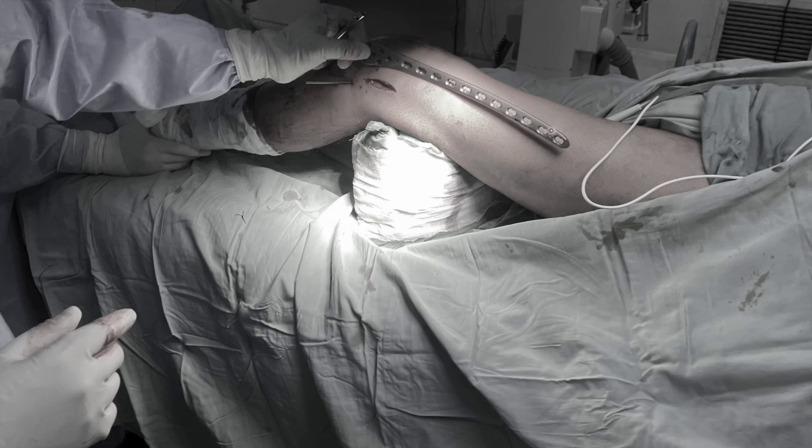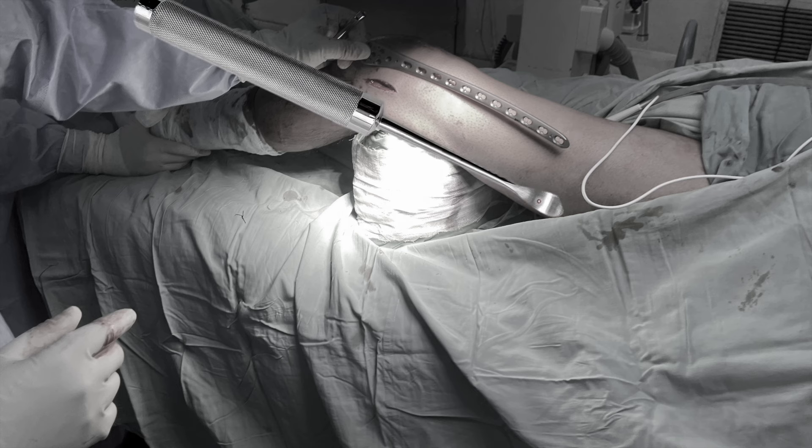Once the iliotibial band has been split, you can simply use your index finger to bluntly create a space underneath it for placement of your plate. The terminal part of the plate is smooth and tapered both in AP and mediolateral extent. This smooth tapered part can actually be used just like a periosteum elevator that will create a space in a submuscular plane. If you are not comfortable, you can use a Cobb's elevator also to create space for positioning your plate.